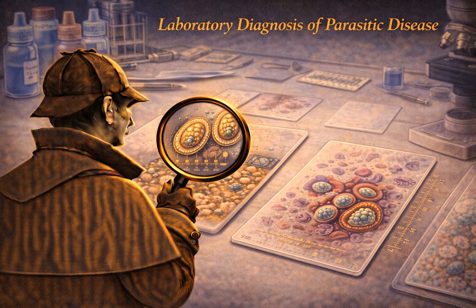What exactly are they waiting for? It is a motility test. Yeah. You literally sit and watch under the microscope for the live microfilaria to actively swim out of the skin tissue fragment and emerge into the surrounding saline pool. It's a real-time observation. That is incredibly vivid.